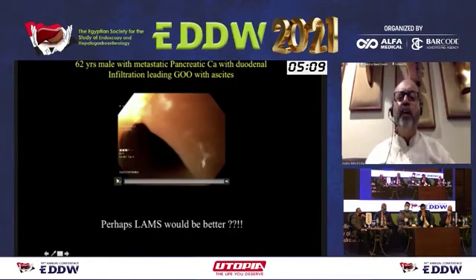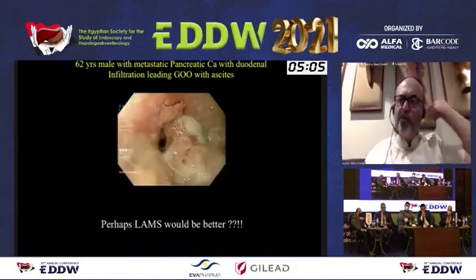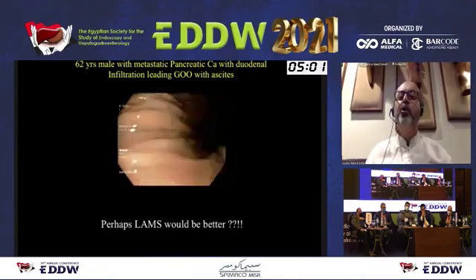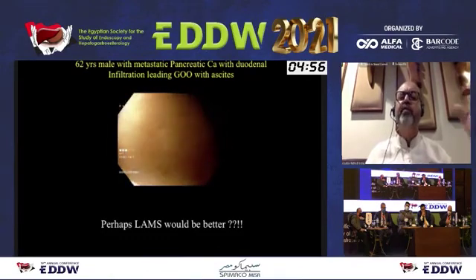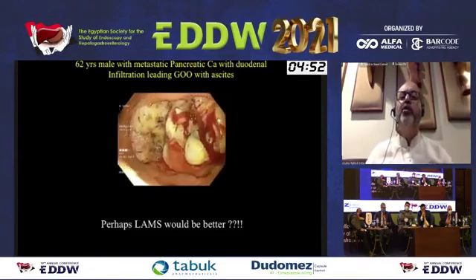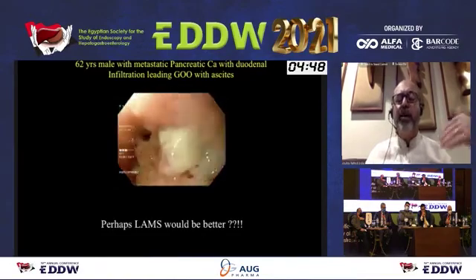If you ask me my particular preference of drainage, I would prefer to do a transduodenal EUS-guided choledochoduodenostomy as the safest possible procedure if there is a massive dilatation of the bile duct, which is impinging on the duodenal bulb region. And this is something which I personally reckon.